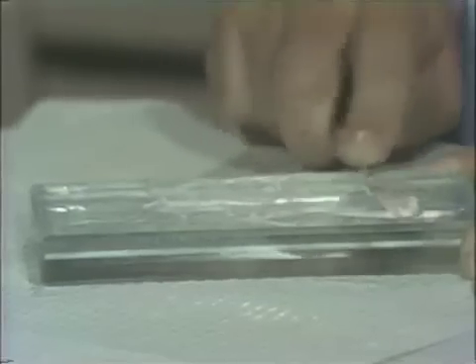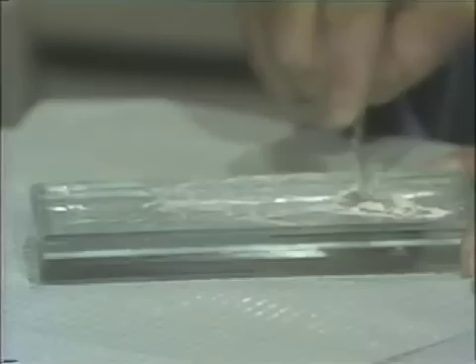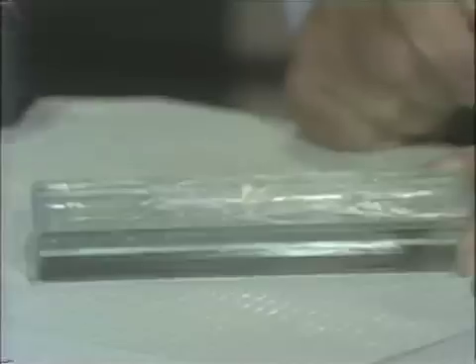This is again rolled in powder. The powder is zinc oxide, which is good for the tooth. And the liquid, of course, is a phosphoric acid.